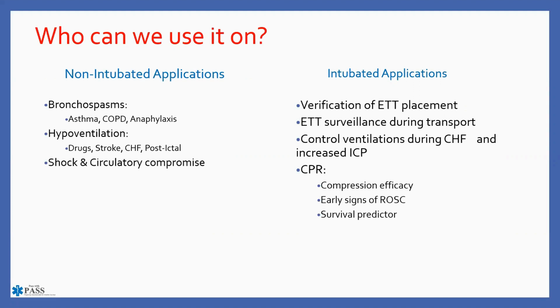Hypoventilation, so drugs, stroke, congestive heart failure, maybe postictal patients after a seizure activity. If they are hypoventilating, we're going to be able to see that pretty easily, and then we can obviously manage our patient care based on those findings. And then shock and circulatory compromise are another good indication for using capnography in the non-intubated patient.